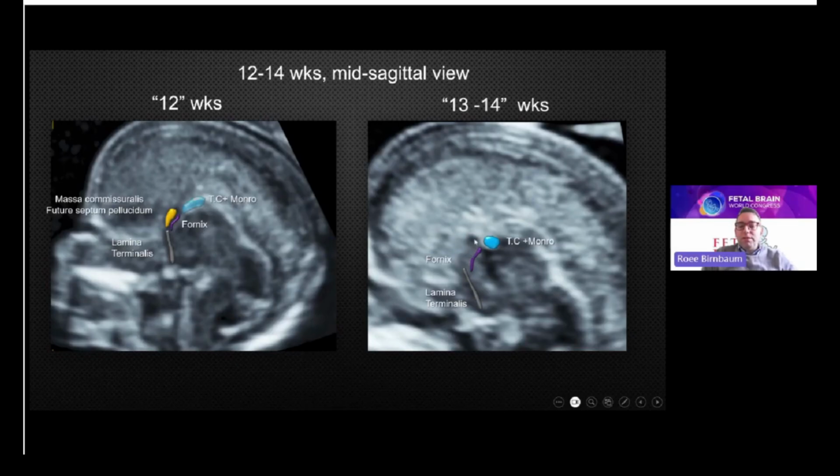I will take it away. You see the difference in the echogenicity. This is the corpus callosum. The very, very early fibers of the corpus callosum are crossing here when you approach 14 weeks, but this is a very, very small structure. But if you have a good insonation, usually you would see it at 14 plus 0, or 13 plus 6 weeks.